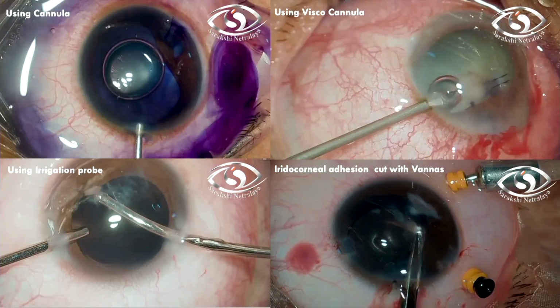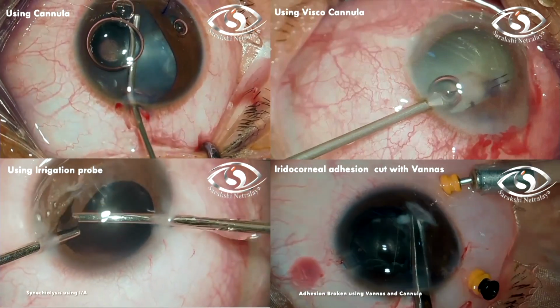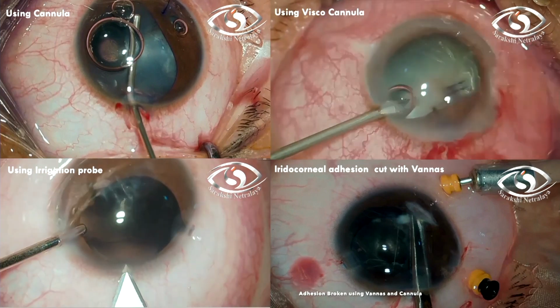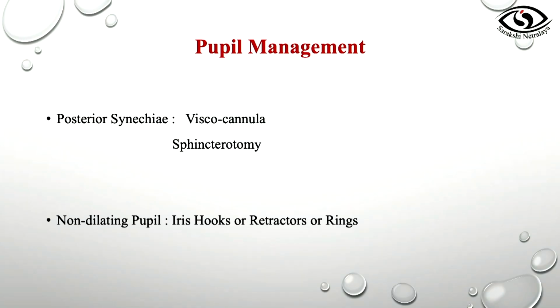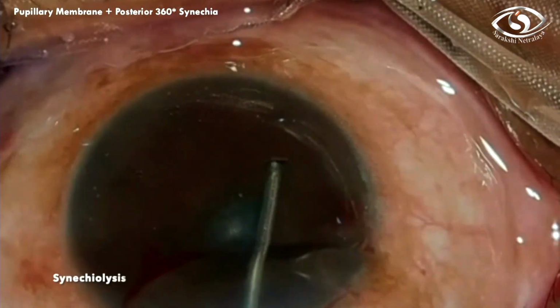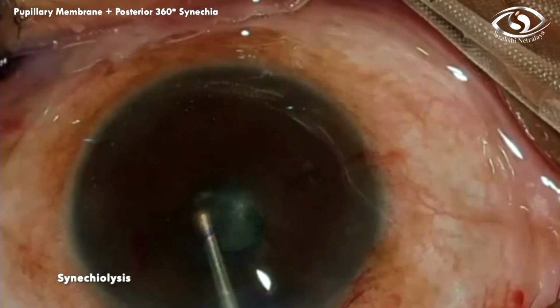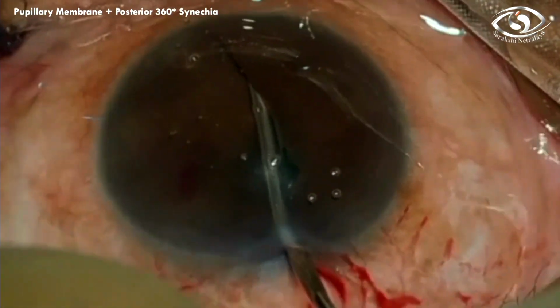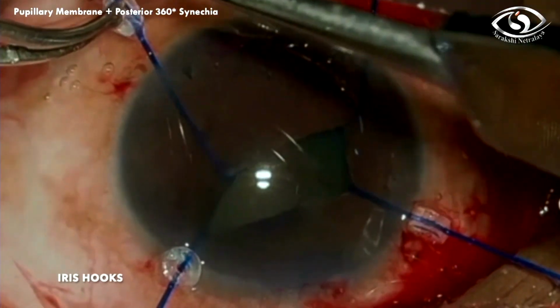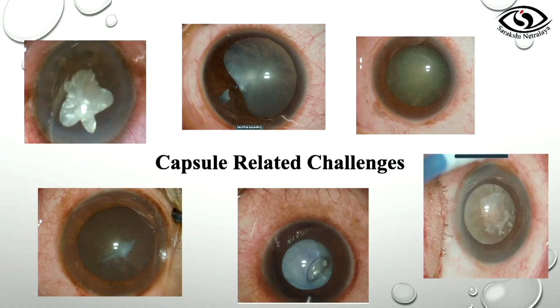Iridocorneal adhesions can be separated with the help of viscoelastic, using a simple visco cannula or the irrigation aspiration port, and this has to be done after you take care of the cataract. Now regarding the pupillary challenges, yes, you have a posterior synechia like this. You use viscoelastic, and you have to use multiple combinations. Push a visco dye there and separate the pupil which is adhered posteriorly, as this was a more than 6 months old foreign body case. Then you put a hook, and the rest of the steps were all simple.